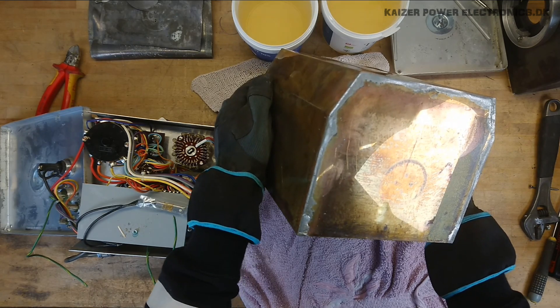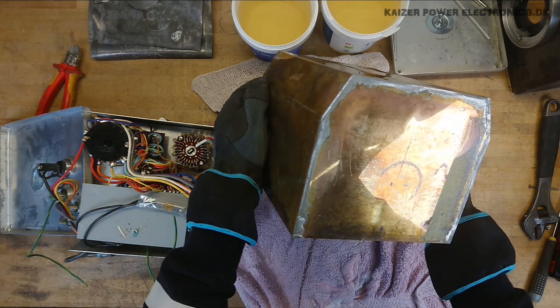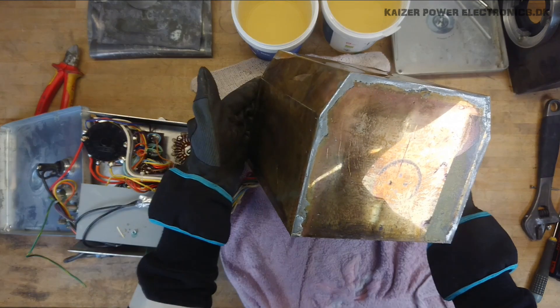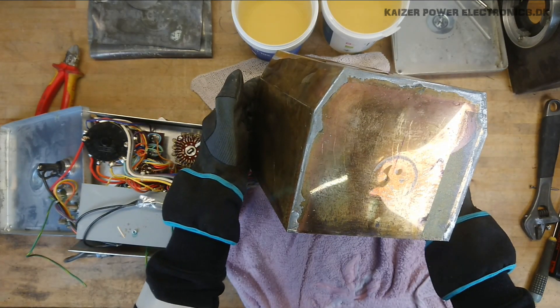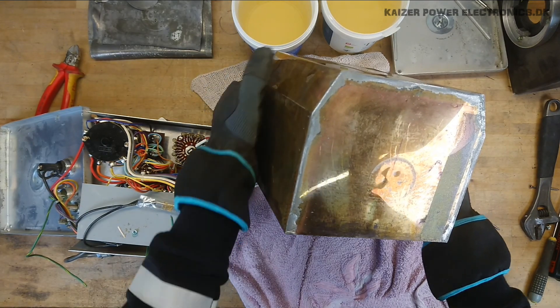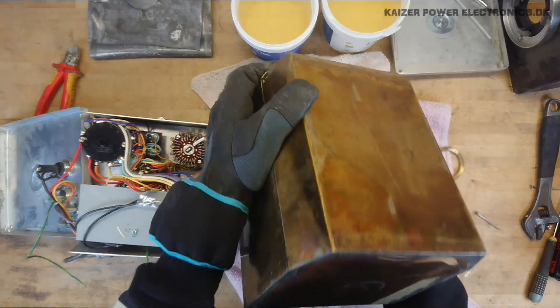So now I actually have to leave it upside down for at least half a day, maybe a day. Maybe I'll film again tomorrow, in order to make sure that as much oil as possible has been drained out from all the components inside.